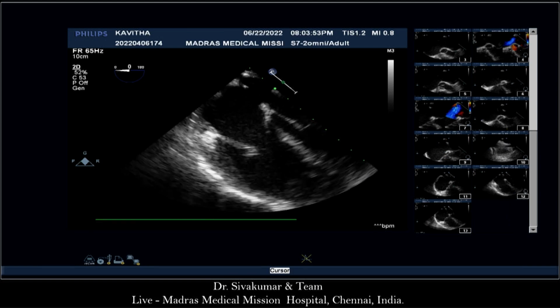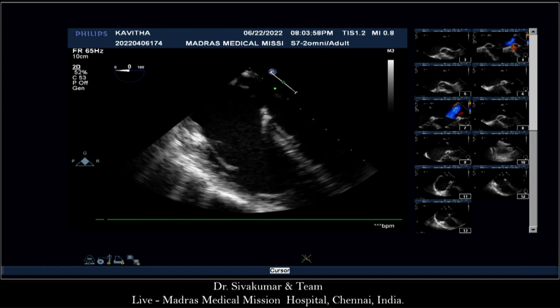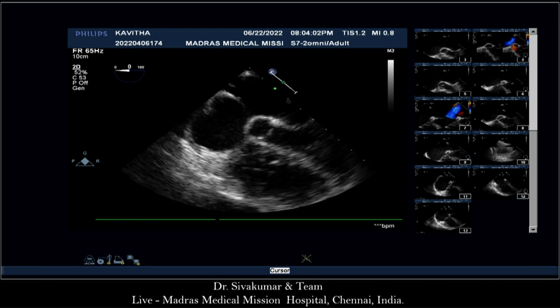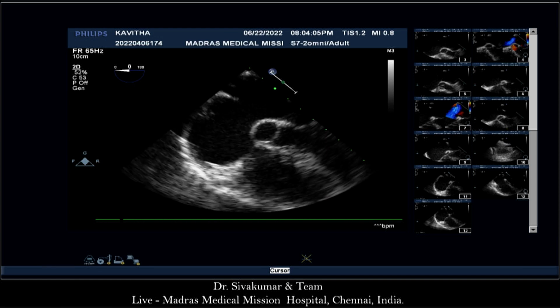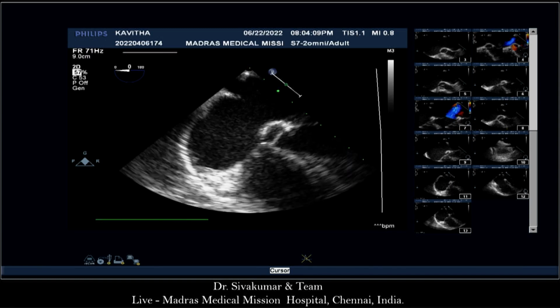How old is the patient? Patient is an adult, 21 years, 21-year-old. Is your wire across it? Yes. Not sheath across, wire across. But I can take it out, I can make it easier for you. The retroaortic rim is bald, now there is nothing inside.